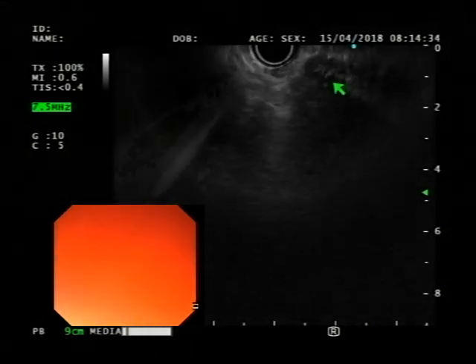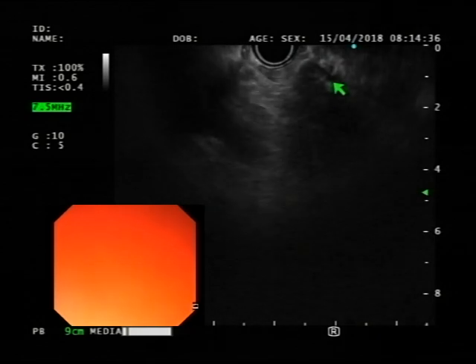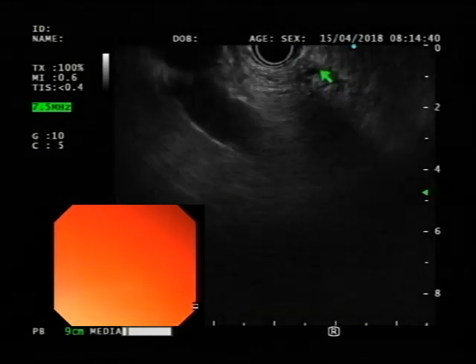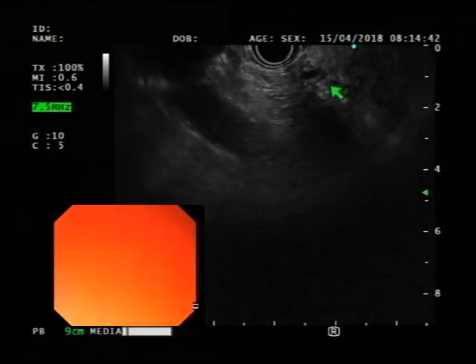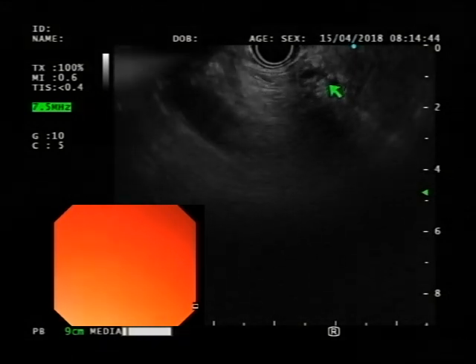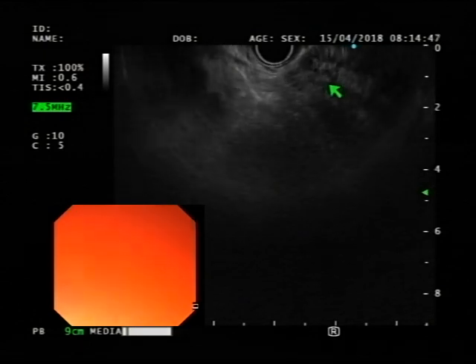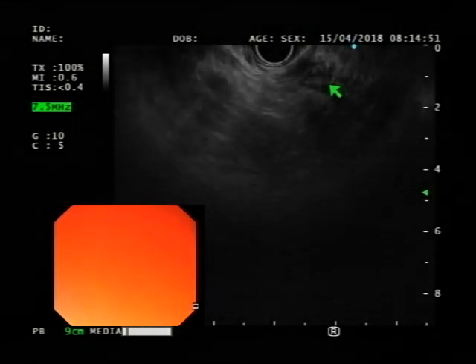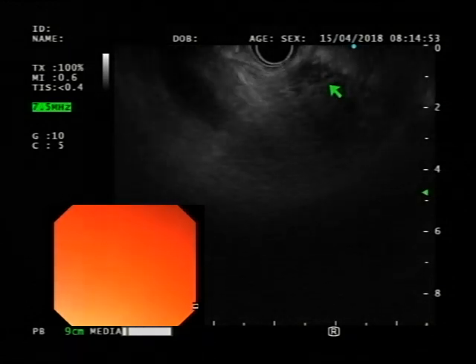And pull. Big wheel towards you. Maintain it, please. This is the vein right there. Looks like a pancreatic duct right at the bottom right there. And we don't see any mass there. It's just an atrophic pancreas.